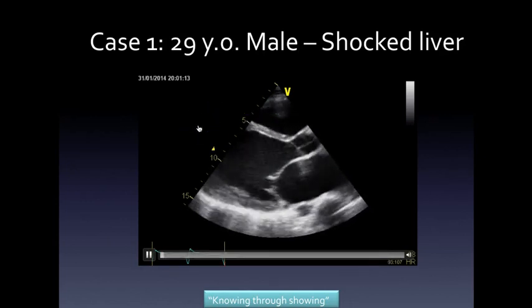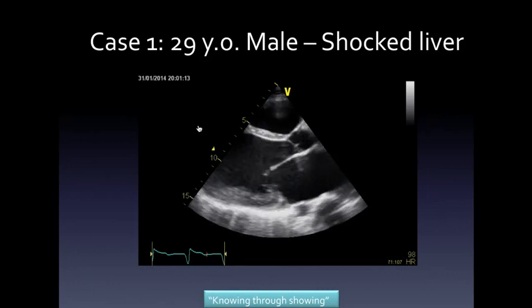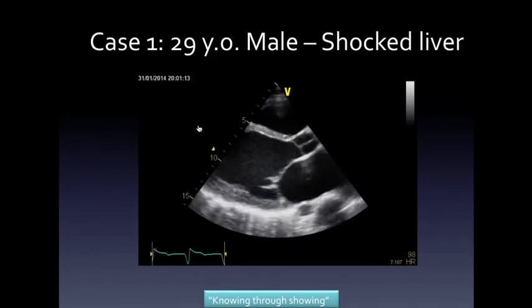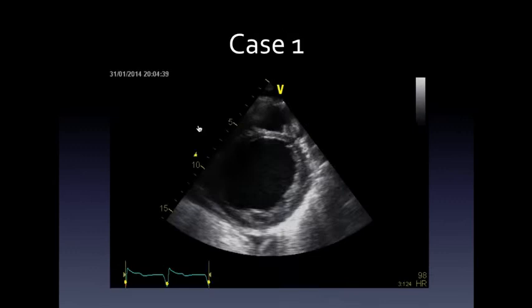So what's the ejection fraction? You can't answer the question because you don't have enough information. This is one view. You can eyeball it and say, it's not good. Now, that could be very useful in a quick setting. So whether the ejection fraction here is 22.3897% or 34, it doesn't matter. This is not a good heart. And I'd argue to you, you've already answered a lot of your questions before you go any further. But let's take another view.